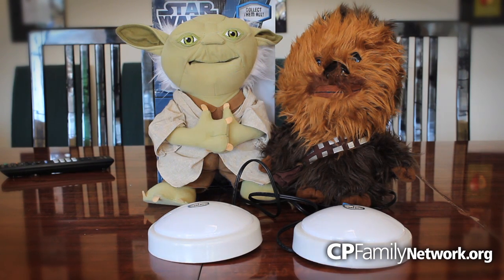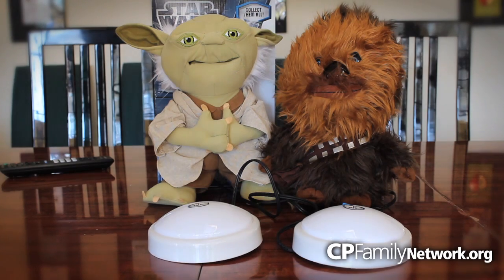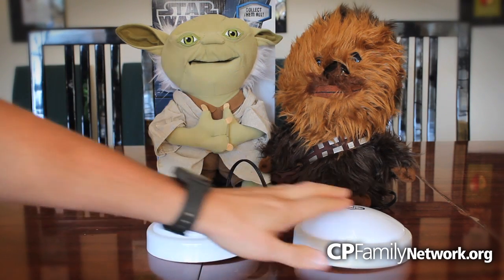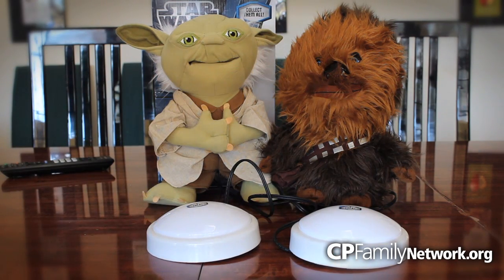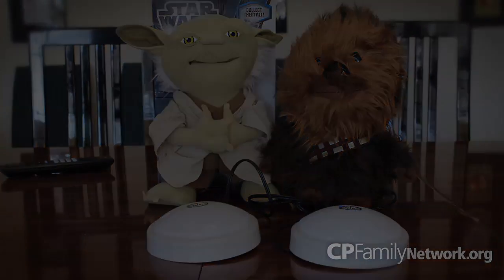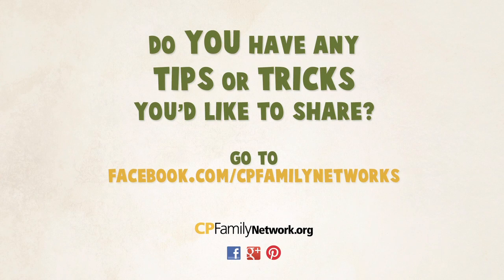And that's it. You can see how easy it is to adapt regular toys to be disability friendly. Do you have any tips or tricks that you'd like to share? Let us know on our Facebook page or visit us at cpfamilynetwork.org.